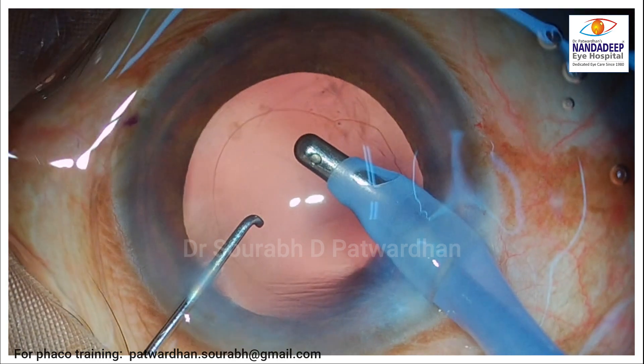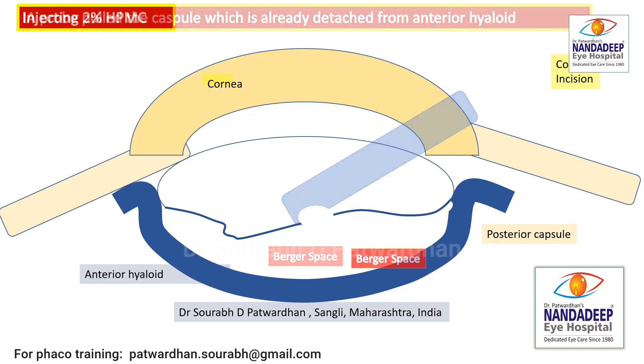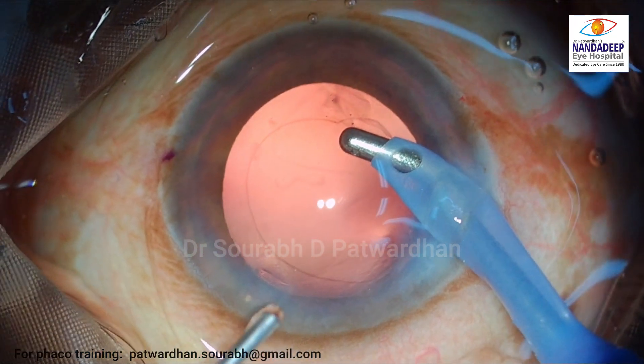So this is what happened: the tip was towards the posterior capsule, I used higher vacuum than what I commonly use for capsular polish, and that led to this tear.